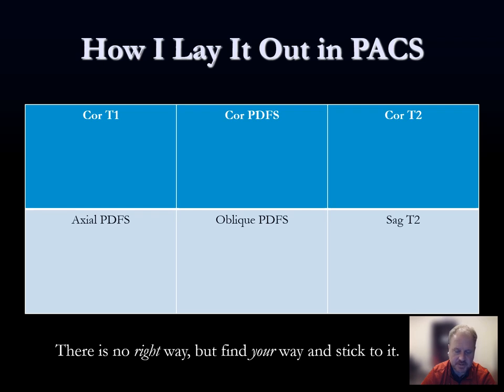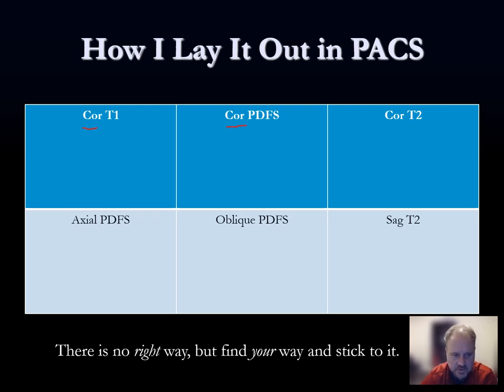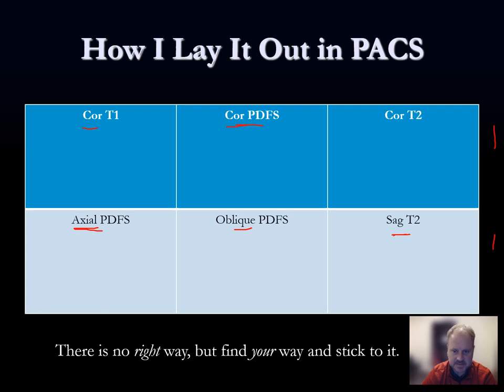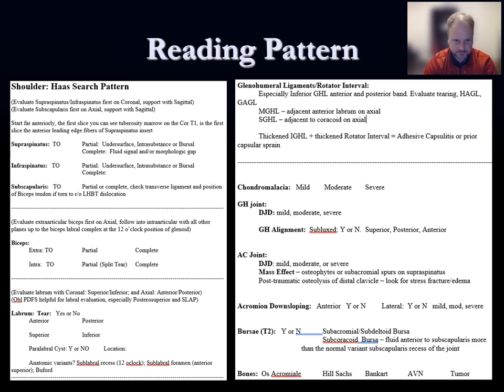This is how I like to lay out the shoulder MRI in PACS. Across the top I'll put my coronal T1, coronal PD fat sat, and coronal T2. Across the bottom on six screens I'll have my axial PD fat sat, oblique PD fat sat, and sagittal T2. That covers everything I need for the current study. If I have comparison exams, I put those on additional screens — at minimum the conventional coronal, axial, and sagittal planes for comparison.